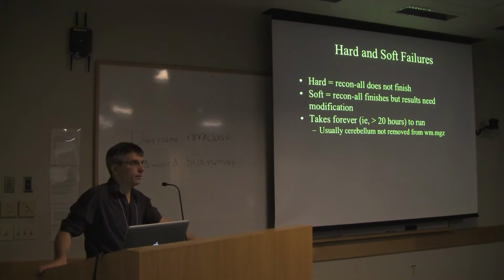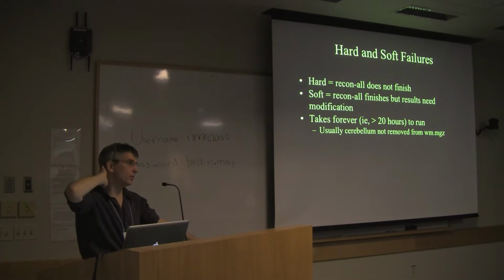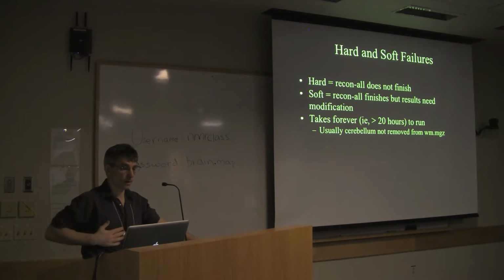So hard failure is when you run recon-all and it doesn't run all the way to the end. And a soft failure means that recon-all finishes, but there's something that it didn't do quite right. So recon-all has a lot of optimization procedures, and one thing about optimization procedures, it'll give you the best that it thinks that it is, but it might not be the right answer.